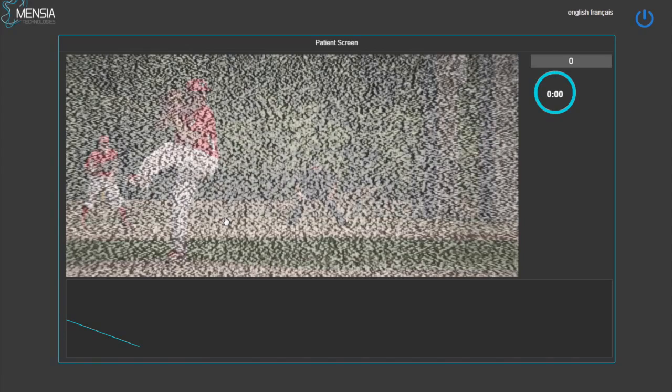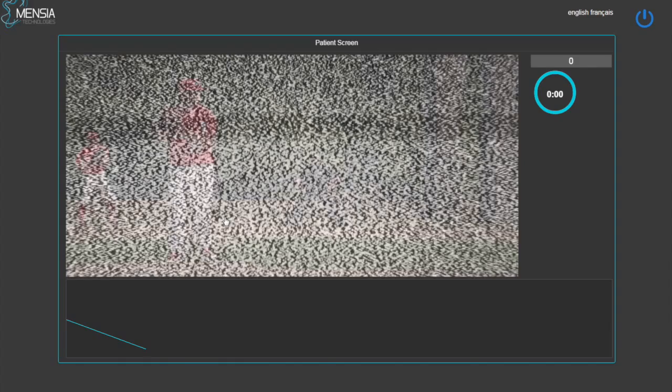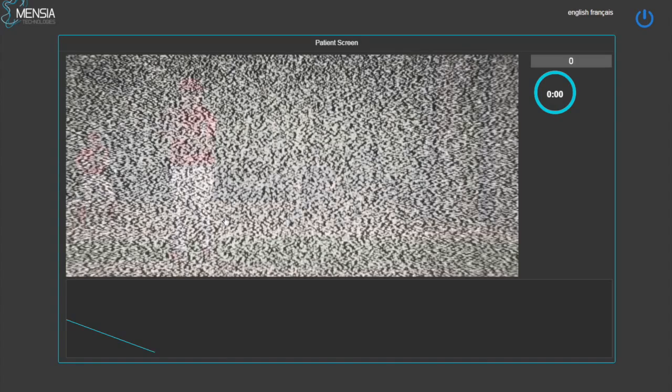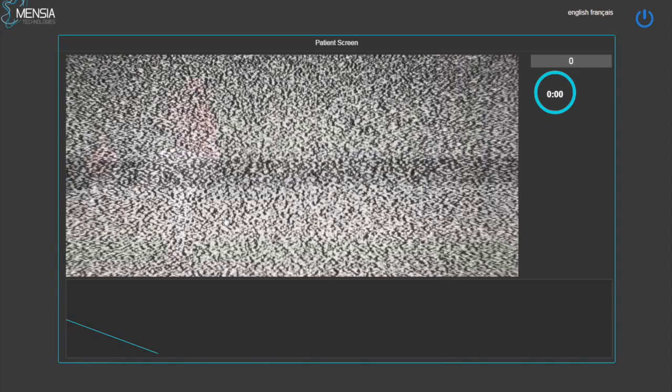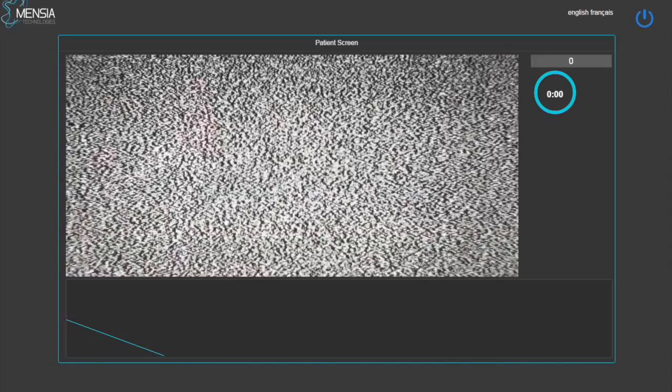So at the end of the first block, you have a little break, just as defined by the practitioner while we set up the neurofeedback session. And at the end of this, you'll get a second session that's very similar to that one.